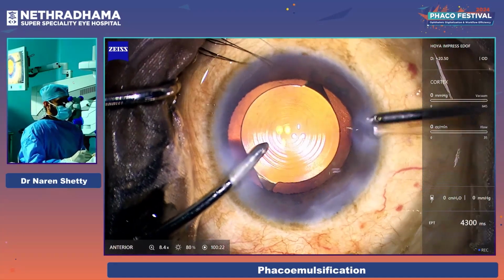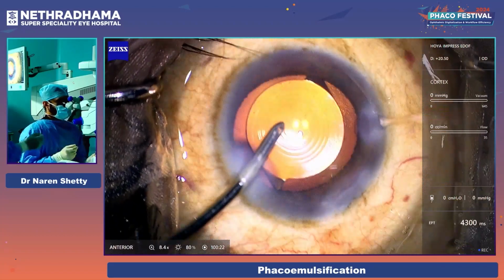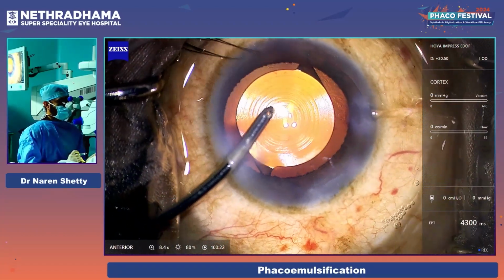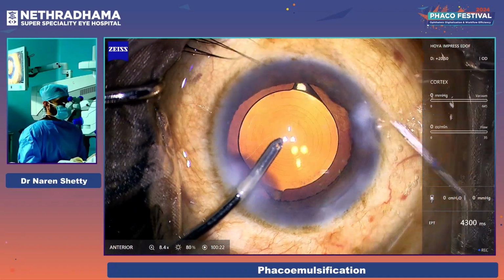Once you do this, just make sure you wash the visco from the endothelium also, and then you're good to go. I think that's about it. Thank you.